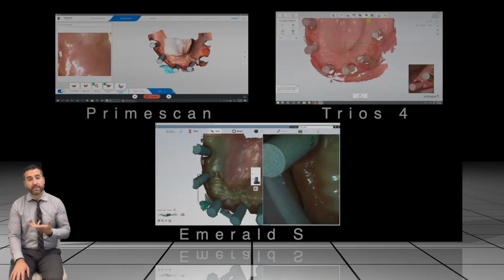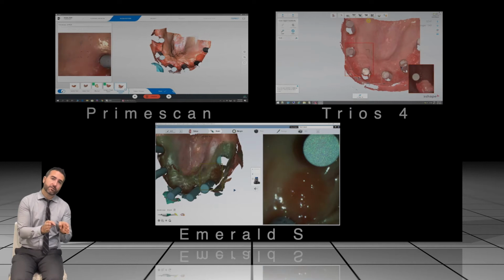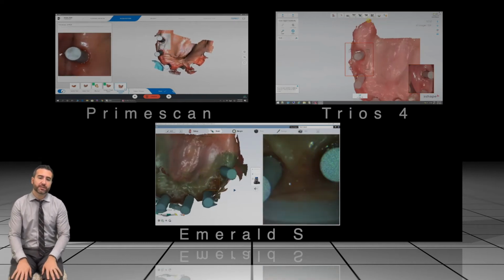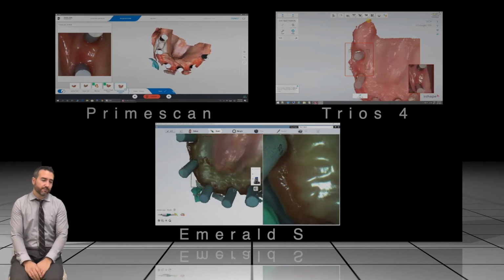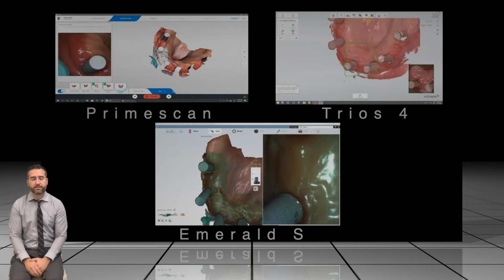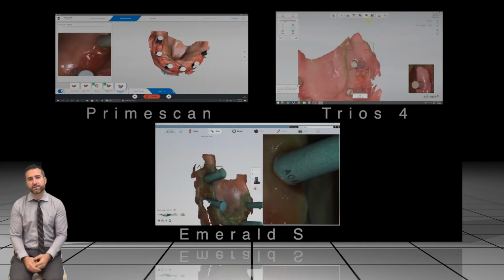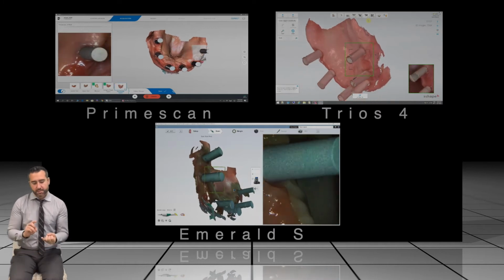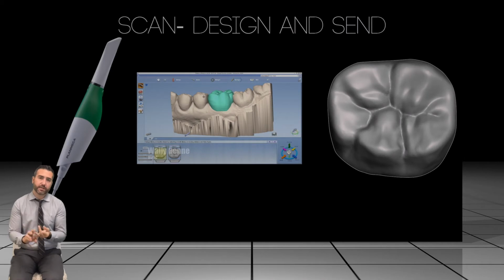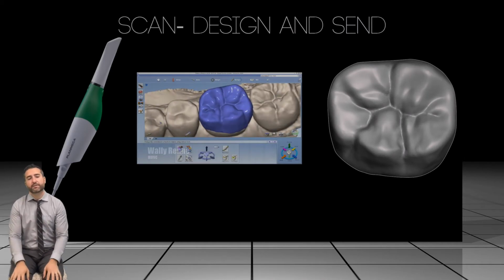And so what does that mean? That means passive fits. And like I said, even if you're beyond that 100 microns, you could have that almost up to 230 microns. You're still going to get good clinical results. It's really remarkable how much easier this workflow is to do with implants, because you're not having to cross mount models. In other words, you're able to scan the provisional, you're able to scan the soft tissue, and you're able to scan the scan bodies and have it all go to the laboratory mounted.